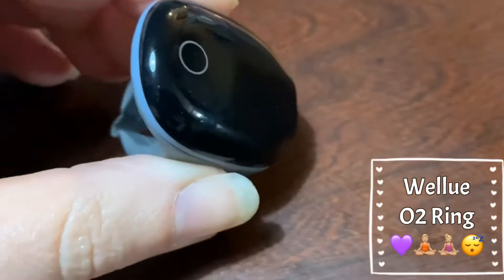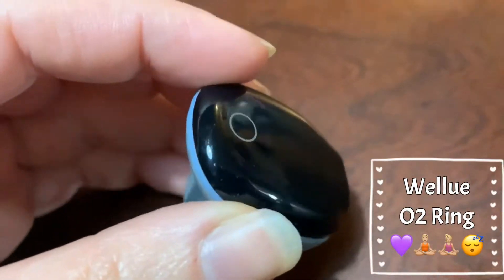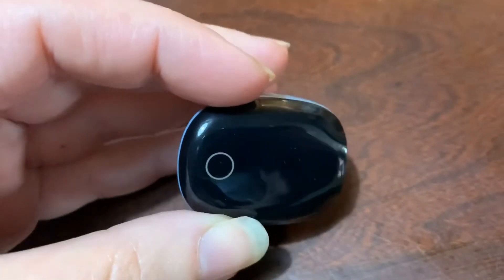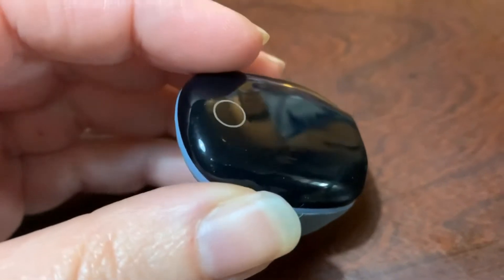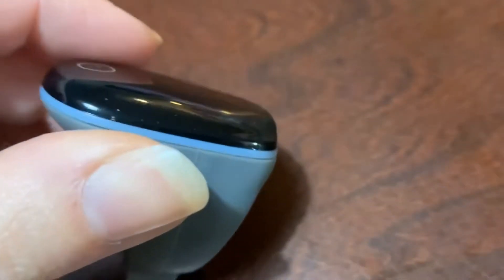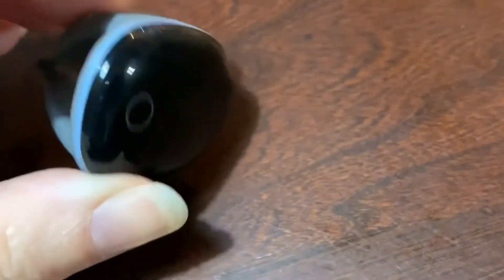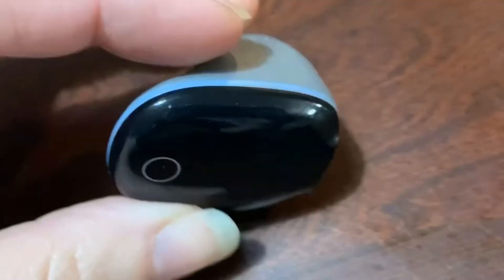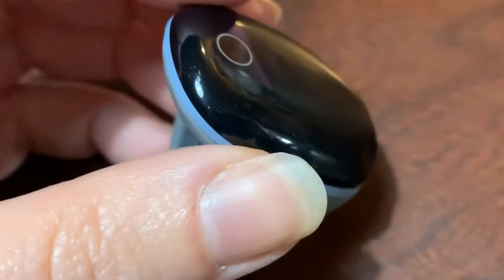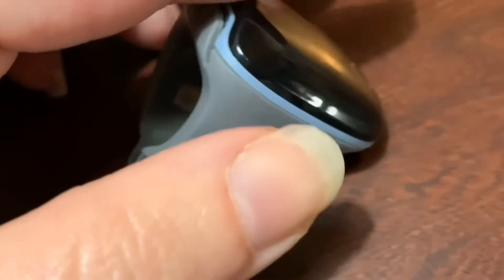This is the WellU O2 ring that I purchased. I wanted to track some of the oxygen conditions I've got going on and hopefully have a more restful sleep, because I just feel like I don't get restful sleep in general. I want to figure out what's going on when I'm sleeping and maybe change some habits so I can become healthier and get a better oxygen-rich sleep, sleep longer throughout the night, and change a few lifestyle things. I just want to show you a little bit about how this works.